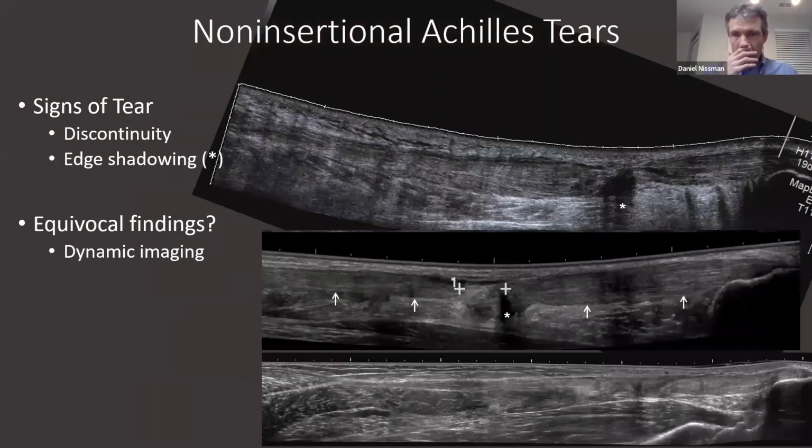One thing that I like to do is a panoramic view. You have the transducer positioned along the long axis of the tendon, and depending on the manufacturer, they have different names for it, but you basically slide it along. I usually start here and slide it proximal, and then it stitches the images together, and so you can get these nice panoramic views of the tears. So here's a nice tear in the setting of diffuse tendinosis, another tear in the setting of more diffuse tendinosis as well.